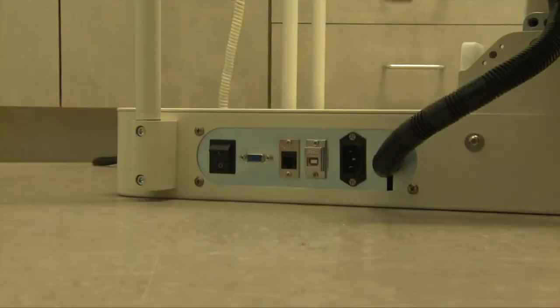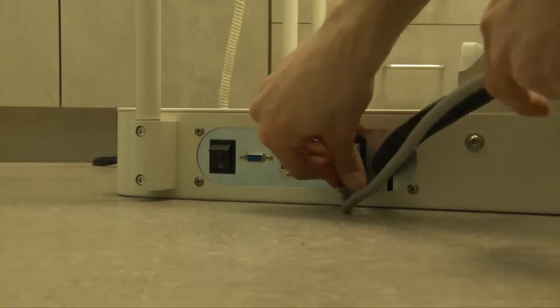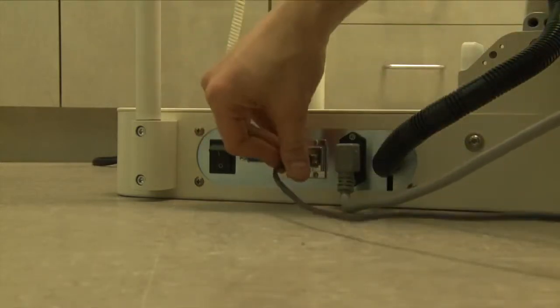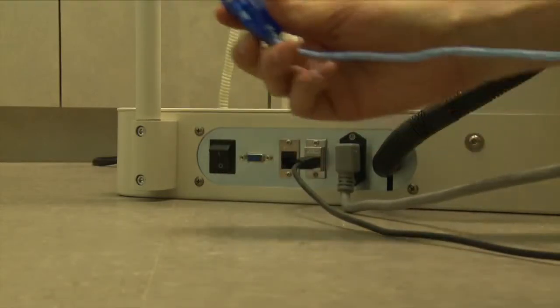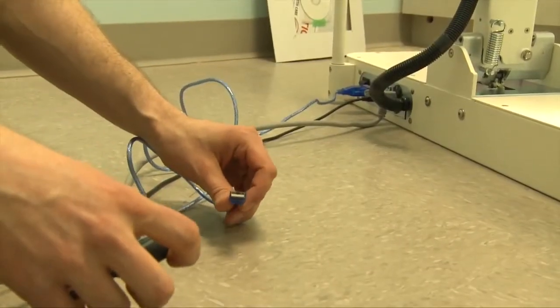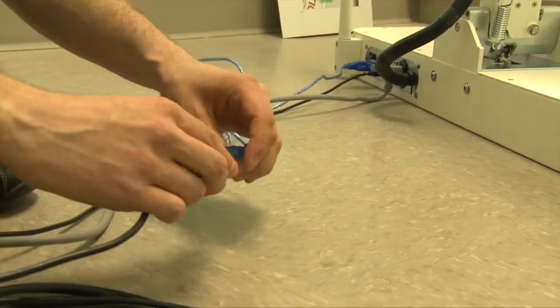We'll install the cables to the back of the base starting with the power cable. Next, the USB cable in the panel. And finally, the serial cable. Now plug the USB serial cable from the base into the extension provided so that it reaches the computer.